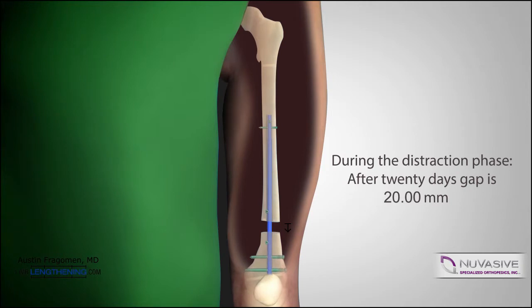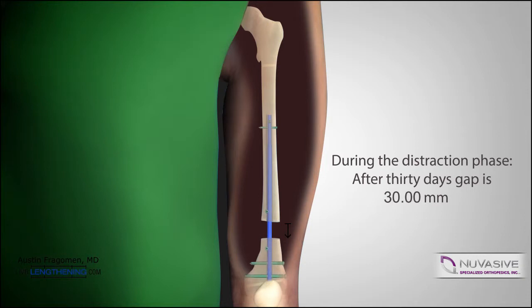In this case, we wanted 30 millimeters of length, so it took approximately 30 days to achieve that length. The patient is followed every 10 to 14 days postoperatively with x-rays to ensure that we have achieved the length we want.